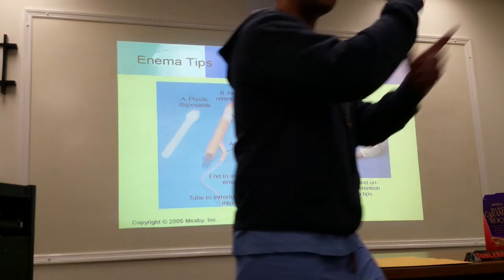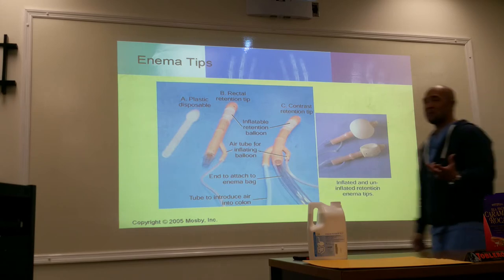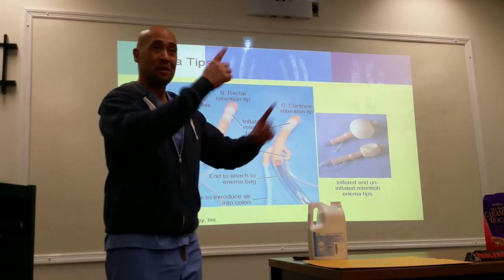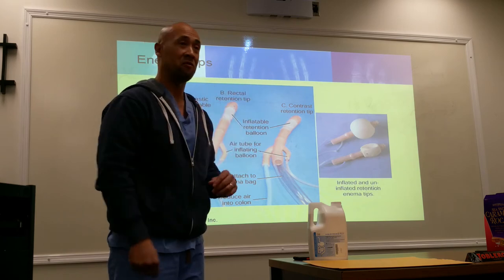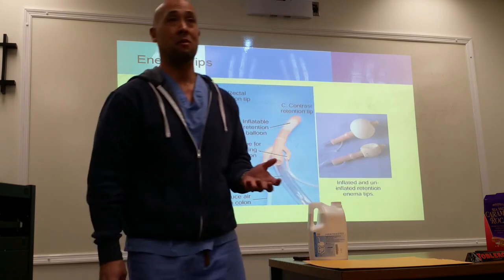As they're moving around, you want to prevent them from getting tangled up on this line. Because if they get tangled up, they can easily dislodge the catheter tip, the enema tip. So one of your responsibilities as a technologist is to move the lines as the patient's moving around, to make sure they don't get tangled while they're trying to obtain those different positions for the fluoroscopic portion of the exam.